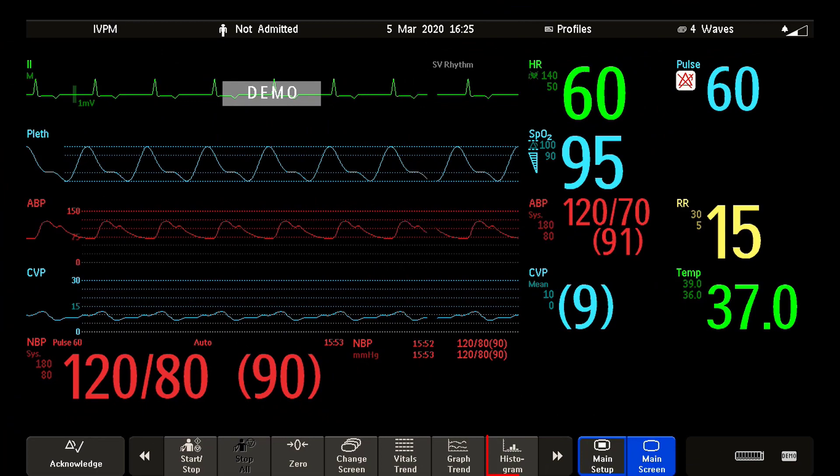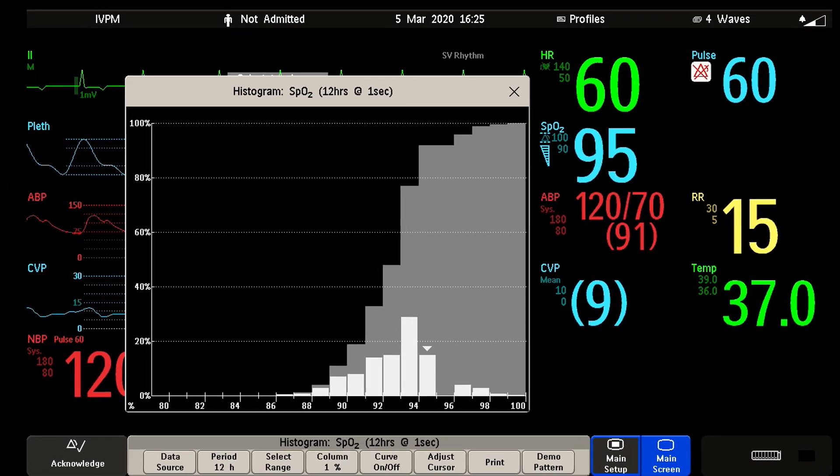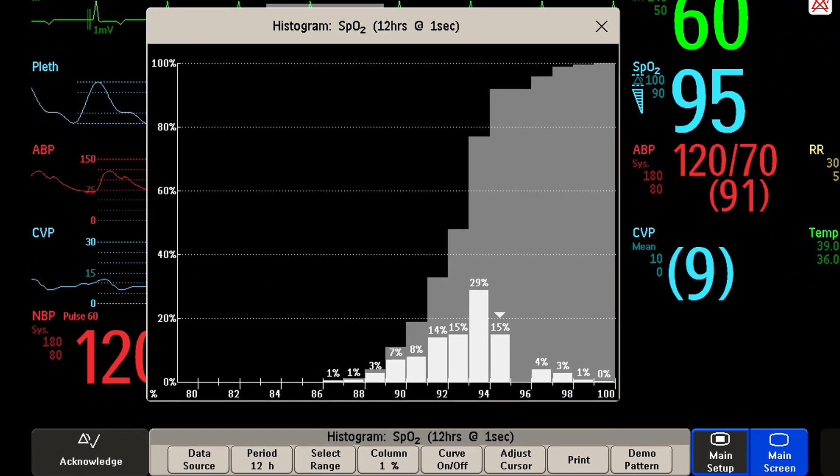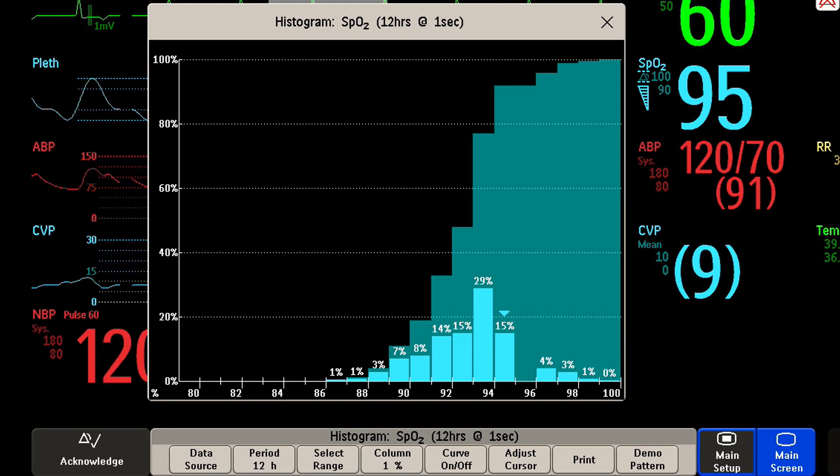Now let us take a closer look at histogram trends. Histogram trends are graphical trends showing the percentage of time that a measurement value is within a specific range. This is useful when it is important to know the amount of time a patient was in a certain range.